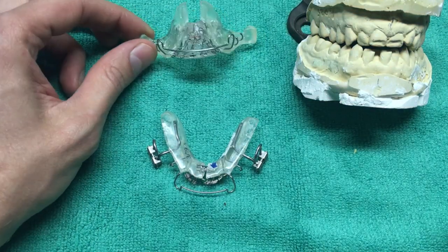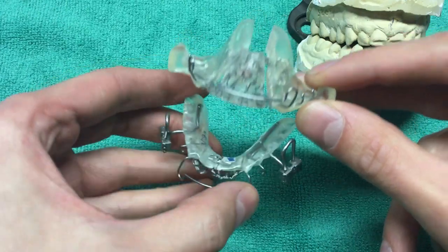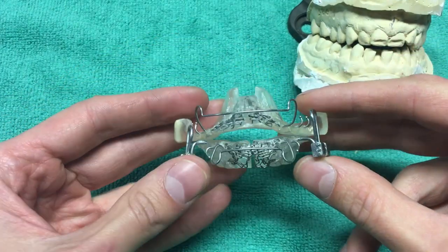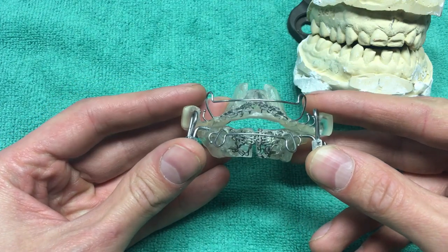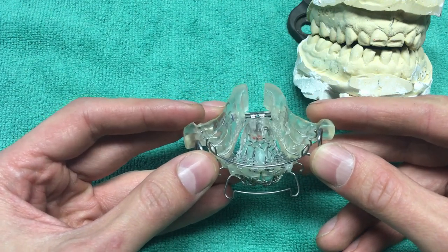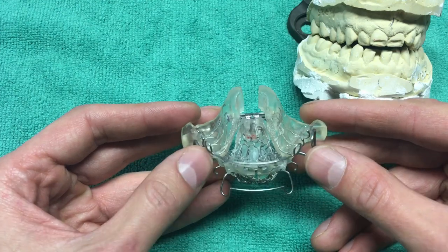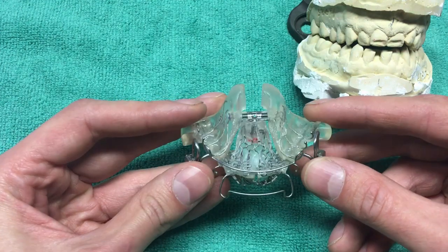Hey everybody, Jimbo here. We're going to talk about this DNA appliance — these are my DNA appliances. I've got an upper and a lower and I got both at the same time. DNA stands for Day Night Appliance. You're supposed to wear it during the day and also during the night, for a total of 14 to 16 hours, so I manage my out time which is about eight to ten hours.